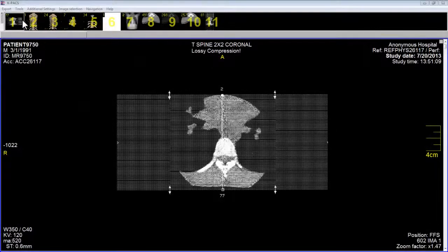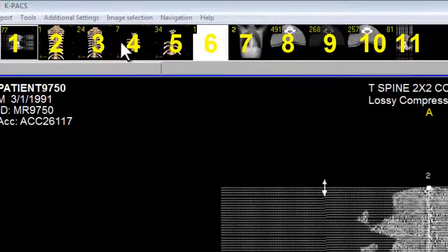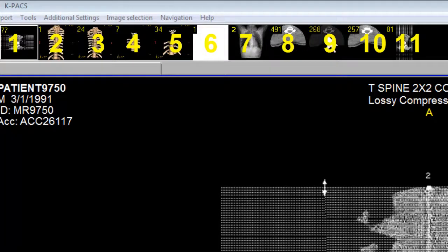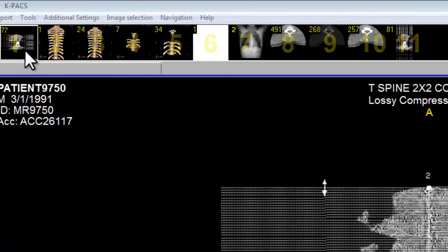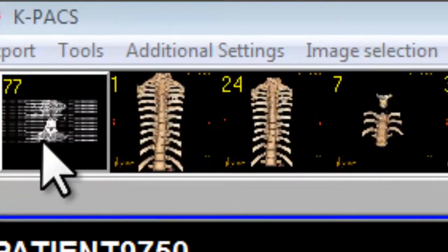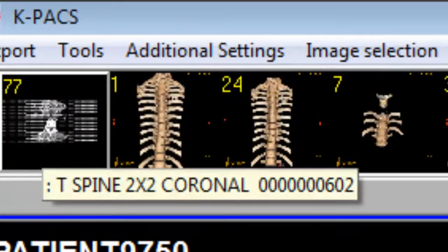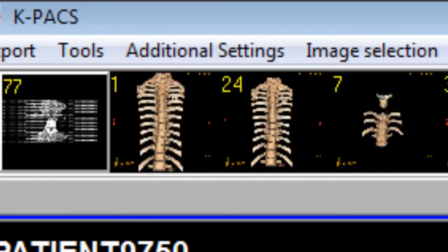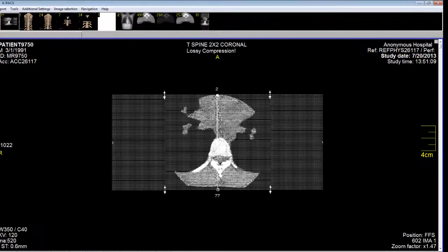There are 11 stacks in total. What's being displayed is the first image in the first image stack. If I put my cursor over this image stack, it says T-spine coronal — so this means thoracic spine coronal sections.